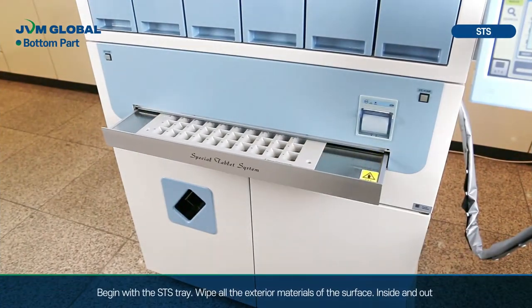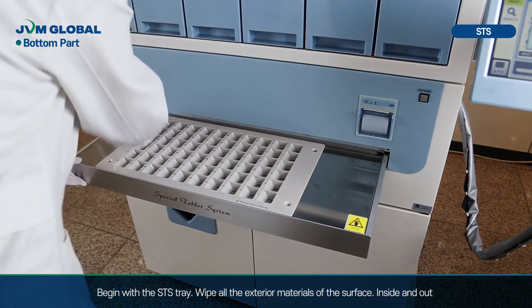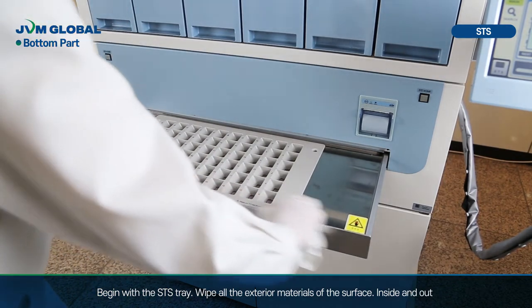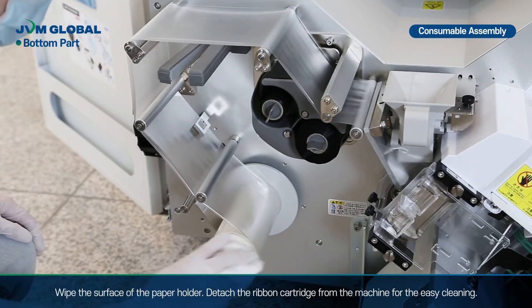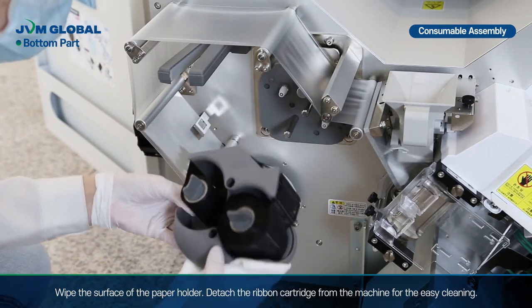Now let's move on to the bottom part. Begin with the SCS tray — wipe all the exterior materials on the surface, inside and out. Wipe the surface of the paper holder. Detach the ribbon cartridge from the machine for easier cleaning.